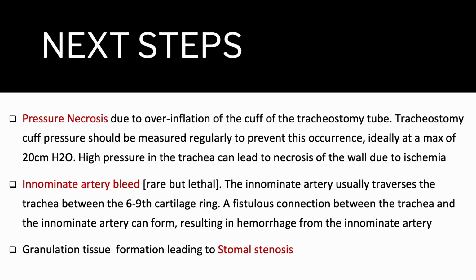Pressure necrosis can occur due to overinflation of the cuff of the tracheostomy tube. Tracheostomy cuff pressure should be measured regularly to prevent this occurrence, ideally at a max of 20 centimeters H2O. High pressure in the trachea can lead to necrosis of the wall due to ischemia.